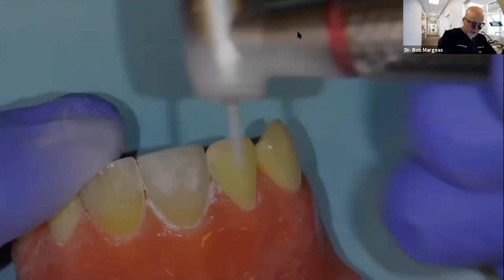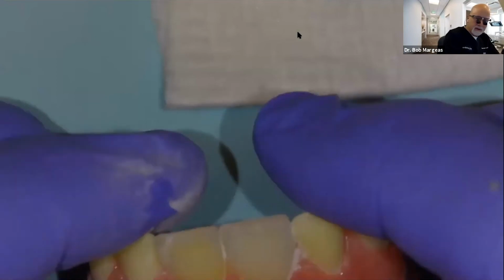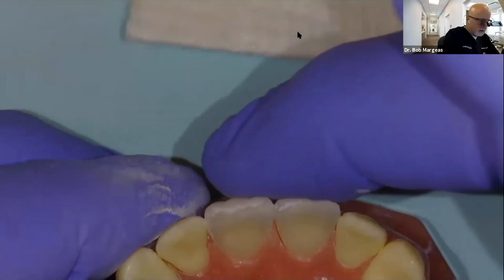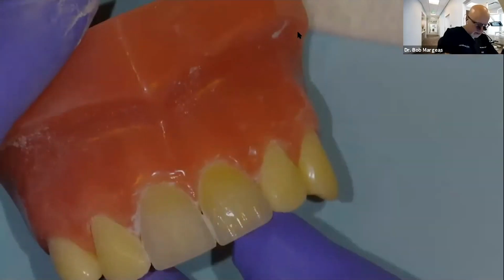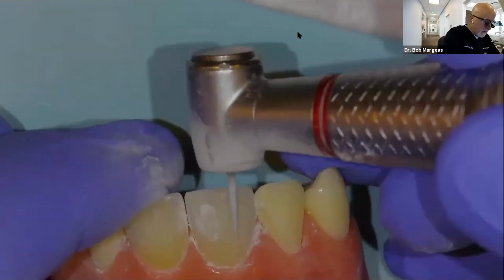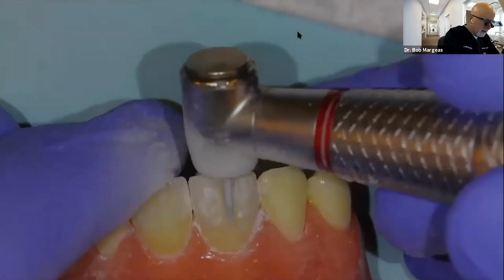Now, sometimes you'll see, like we see in the adjacent tooth, a depression on the interproximal and a depression in the center of the tooth. You can see here, I've got my 3 lobes, and I'm going to get the depression here in the center also. So a lot of times what I'll do here is this. I'll continue on and then I'll split this a little bit like this.